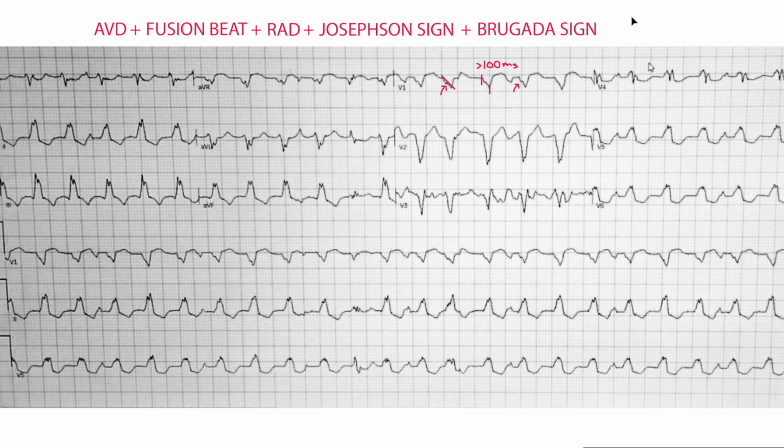There are many used to discern ventricular tachycardia. And if you want to get good at diagnosing and discerning ventricular tachycardia, you have to know them, or at least be able to look them up rather quickly. Realistically, you do have to know them, or at least kind of know of them, and then be able to go back to one of those criteria and pull it up.